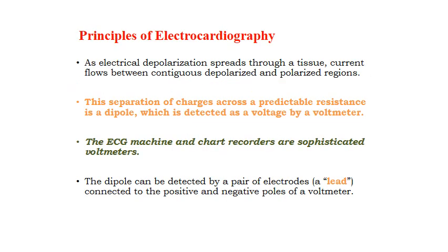Coming to the principles of electrocardiography, it is the electrical depolarization spreading through a tissue, and the current flowing between the neighboring regions which are polarized and unpolarized. This separation of charges, or this difference of charge, can be recorded by using a voltmeter.